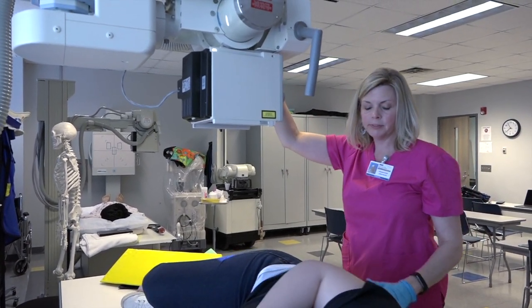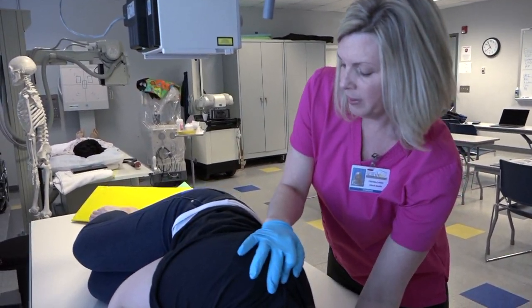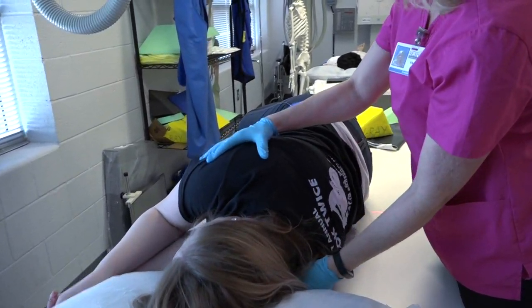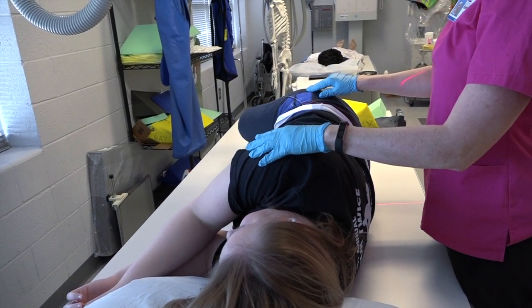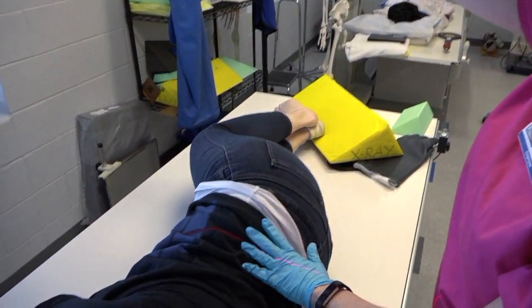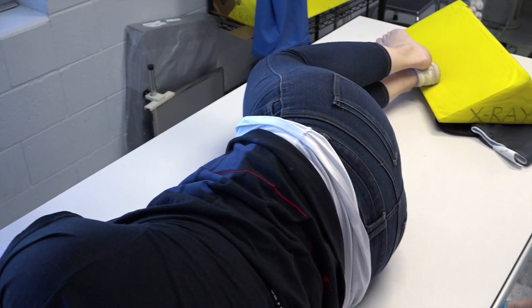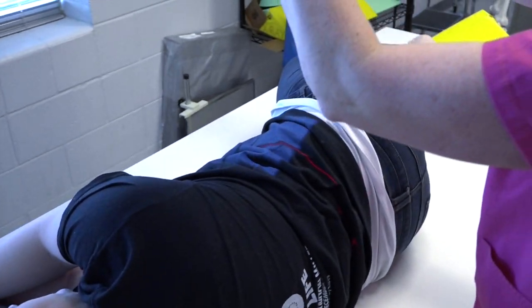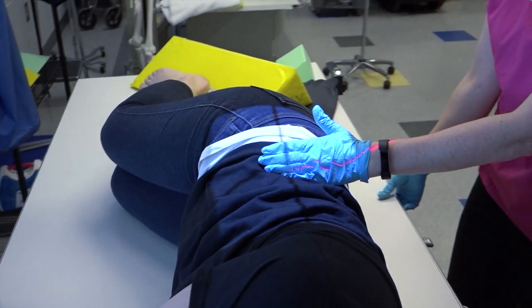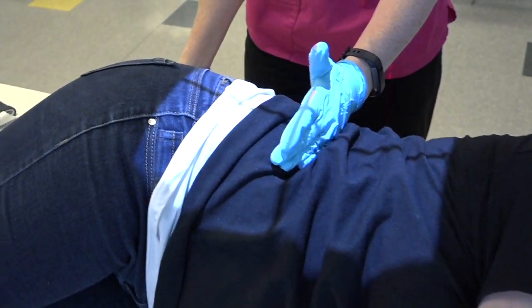Our last two positions are left lateral and lateral spot. So just make sure that the patient is nice and straight. I'm going to move your shoulder back. You want the shoulders and the hips at equal distance apart. So our centering is going to be to the iliac crest. And again, where the patient's abdomen kind of dips in, that's usually where the crest is.